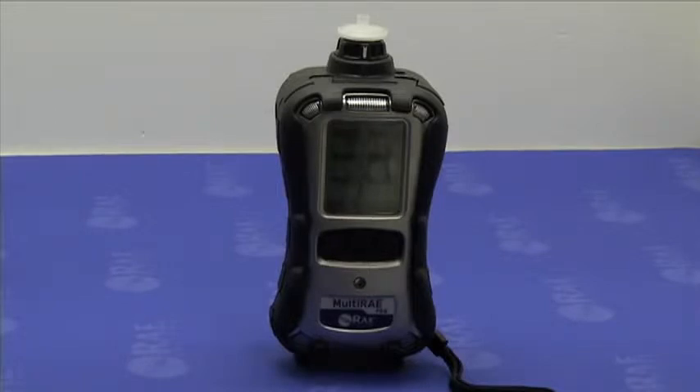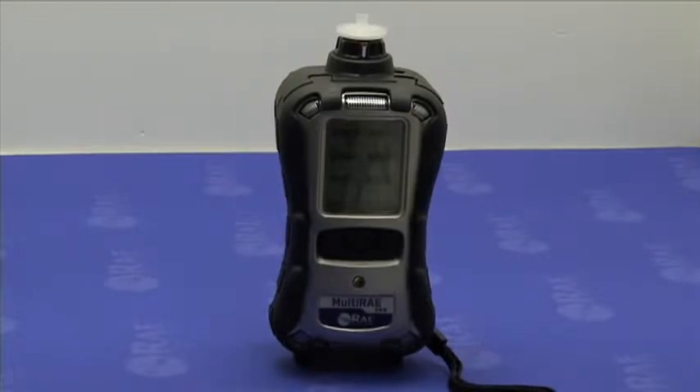The fresh air or zero calibration sets the first point for the sensor calibration curve. Fresh air calibration should be performed in clean ambient air with 20.9% oxygen.